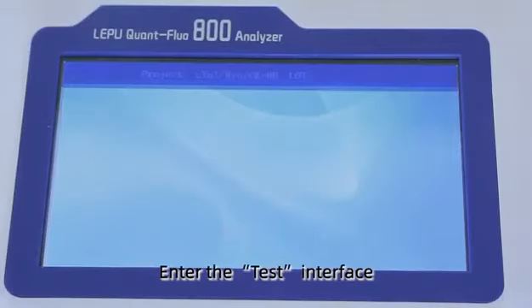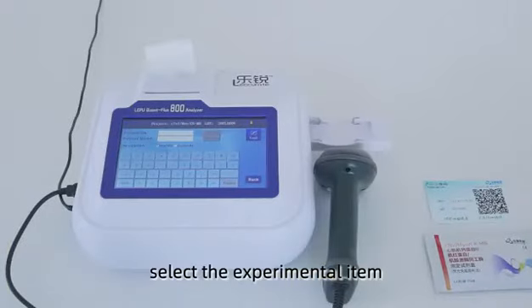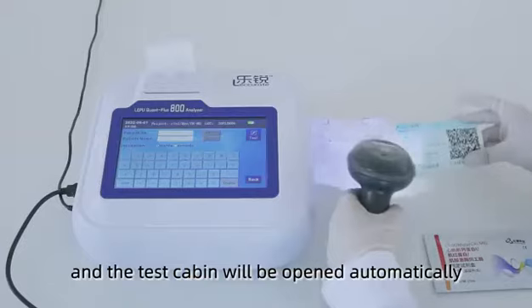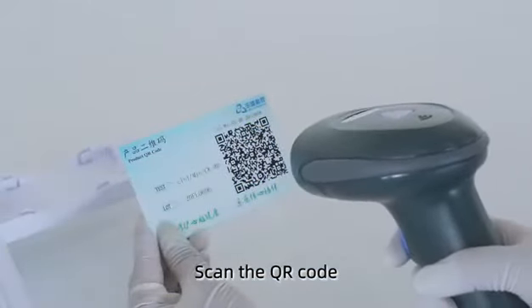Enter the test interface. Select the experimental item and then the test cabin will be opened automatically. Scan the QR code.